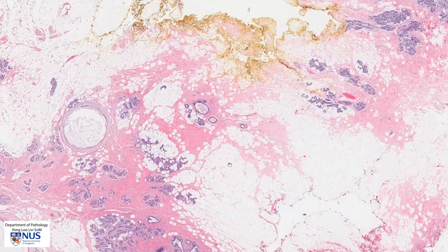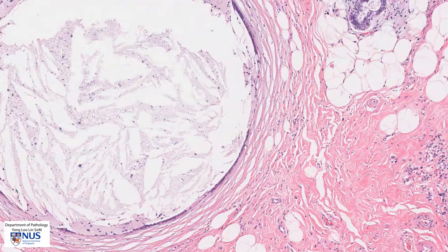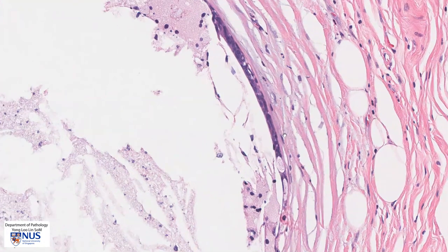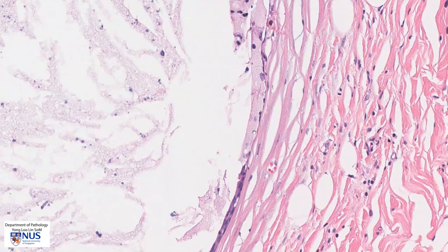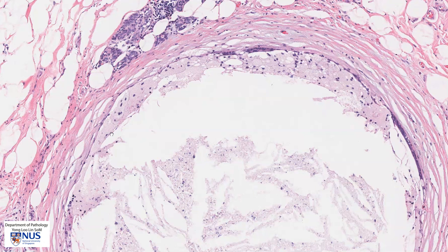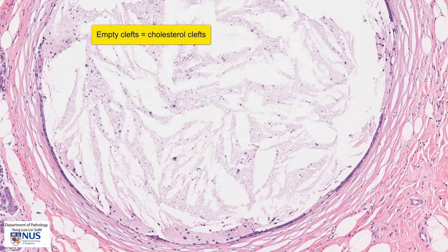Let's move on to look at the cysts. Here is an example of a cyst. In most areas, the lining epithelium is still present — the same bilayered lining epithelium — and you can just make out the luminal and the myoepithelial layer. In some areas the lining is denuded, and the cyst contains plump polygonal cells with very abundant cytoplasm. These are foamy macrophages. There is also granular material with interesting empty clefts, known as cholesterol clefts. There was actually lipid in these areas; however, the lipid got washed out during processing, so all we see left are the empty spaces.